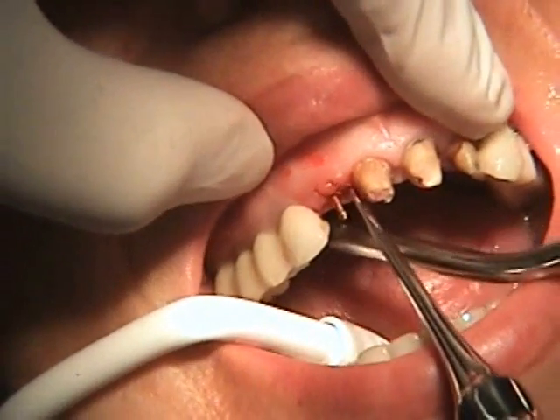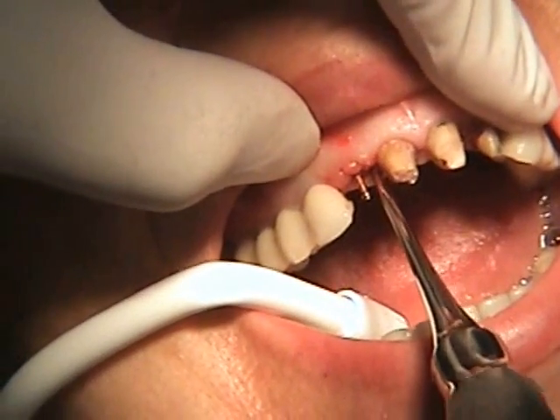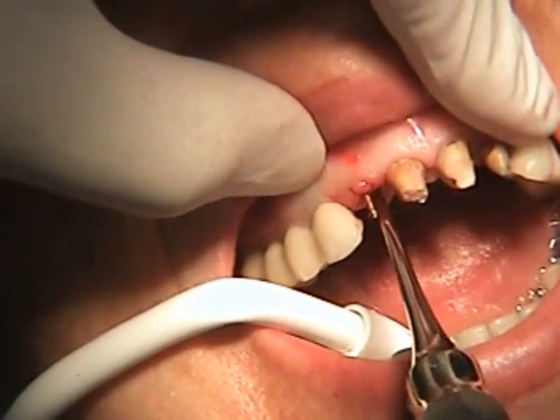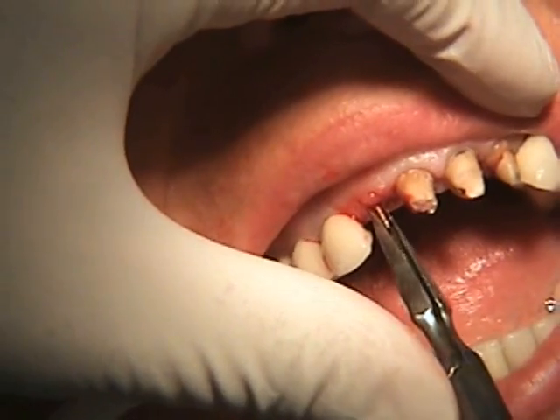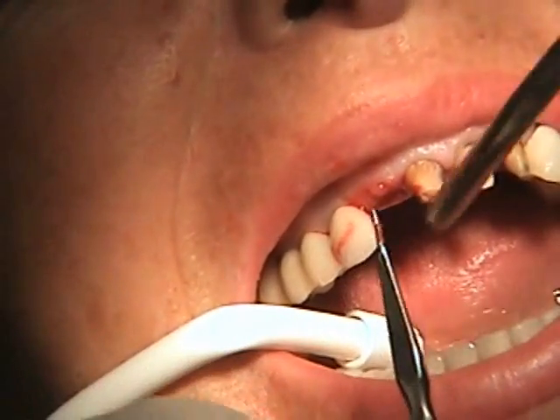After we've done that on the distal, we're going to use a simple luxator and luxate the root just slightly to begin making sure that it's just a little bit mobile. Obviously, we have to remove the pin that's inside the root canal — we're just using a pin remover and rotating it out.